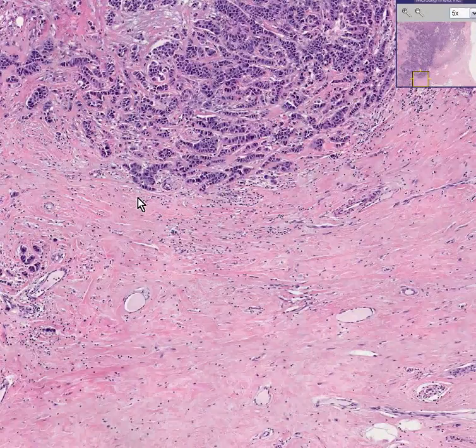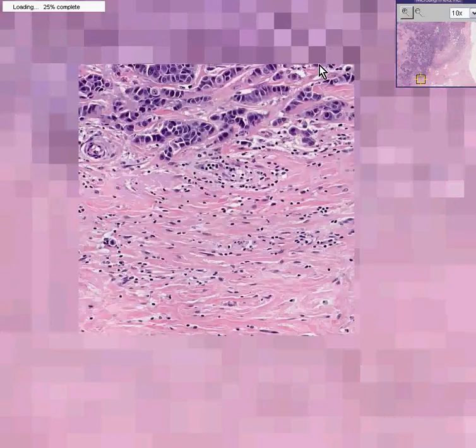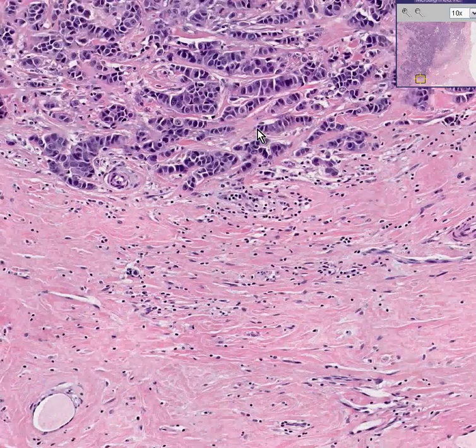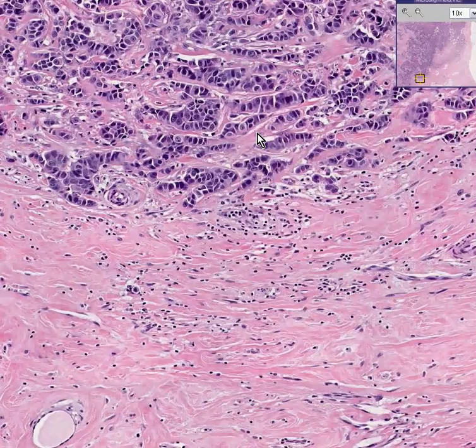Also, classically for most breast carcinomas, these infiltrating nests of cells, which we can see here, evoke a pretty dense fibrous tissue response. So for that reason, when you cut a breast cancer, you can often hear it because it's gritty. It's also why they give most breast cancers the name scirrhous, because the word scirrhous basically means fibrous, but I don't know what language. This is a classical breast carcinoma.